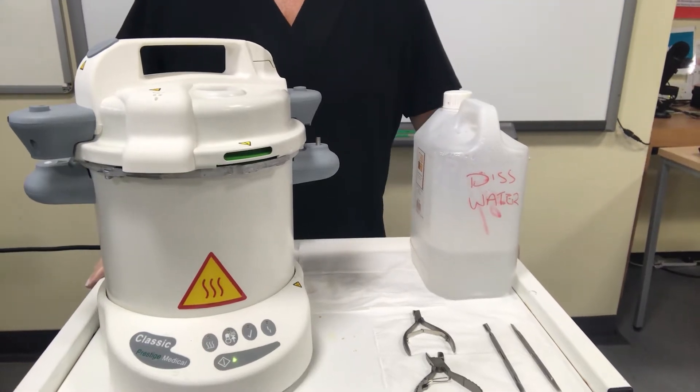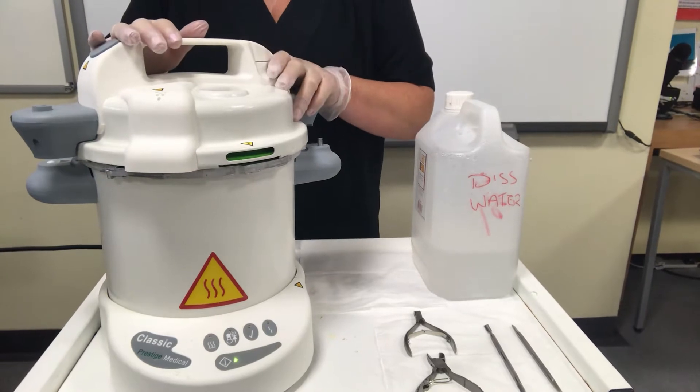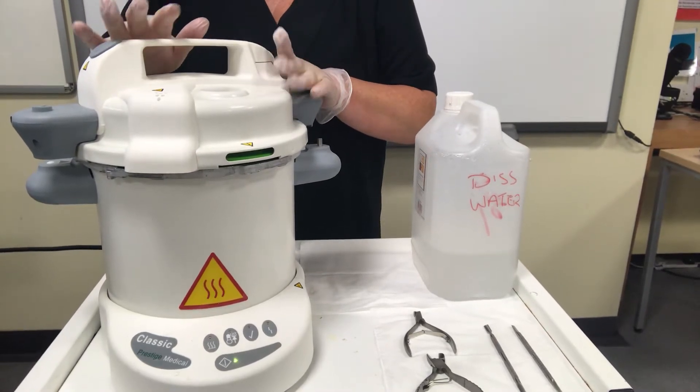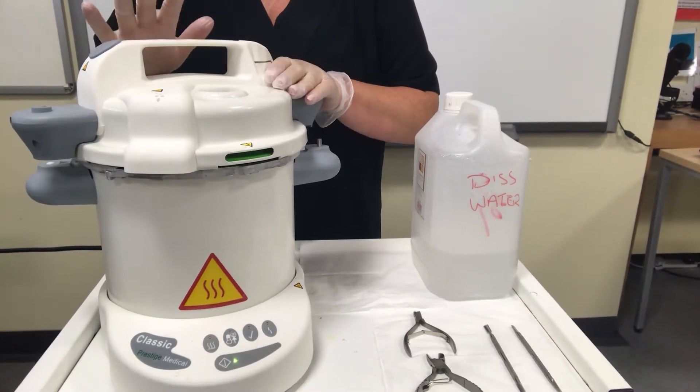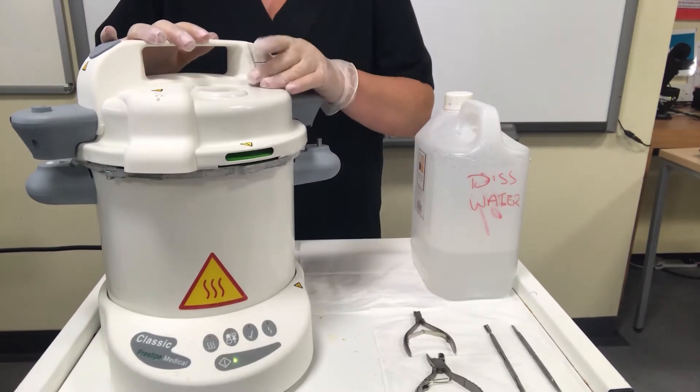We're going to look at methods of sterilization. This here in front of us is called the autoclave. You'll have already come across this and it is used to sterilize metal tools.